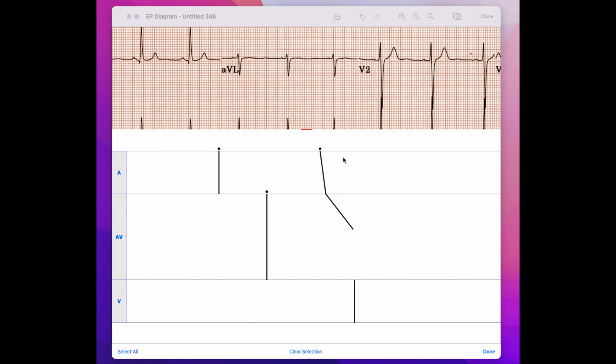Okay, I made a slight change to our diagram. Sometimes when you move marks around and the marks are linked together, you end up with a slanted mark like this. You really want this mark to be straight up and down. Use the Straighten Mark Edit option to do this.